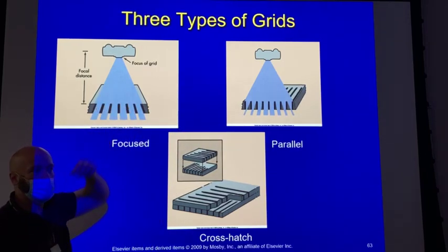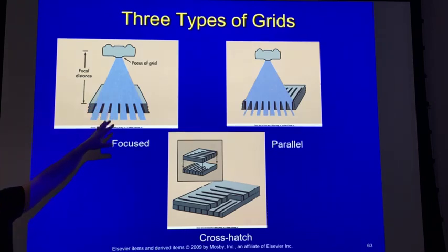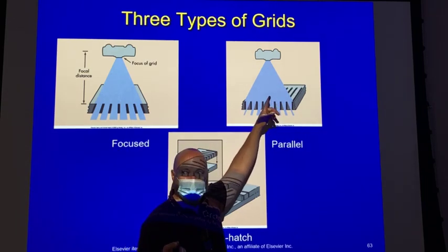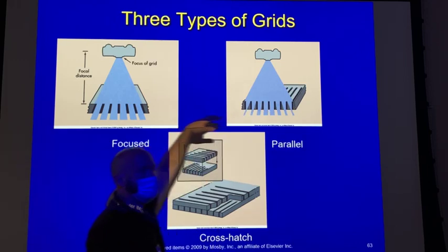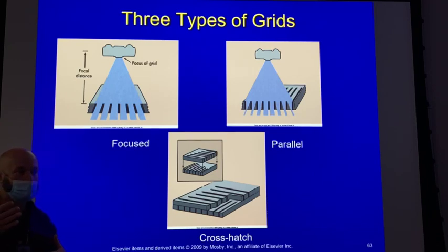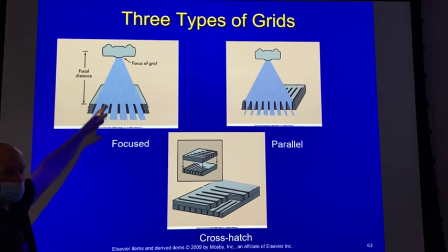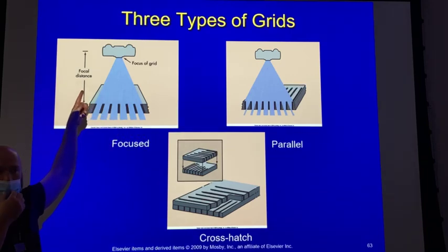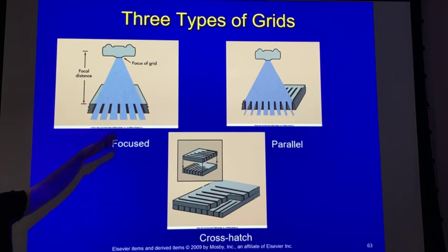You don't see grid strips quite so well. It's what you're going to be using most of the time, so your positioning has to be pretty accurate with it. So the keys you're going to be looking for: grid strips parallel to each other, parallel, positioning latitude, easy to construct. Harder to construct, canting of the grid strips, grid focus, meaning multiple SIDs, right? Inverted grid's a problem, inverted grid's no problem, okay? I think that's pretty much it.